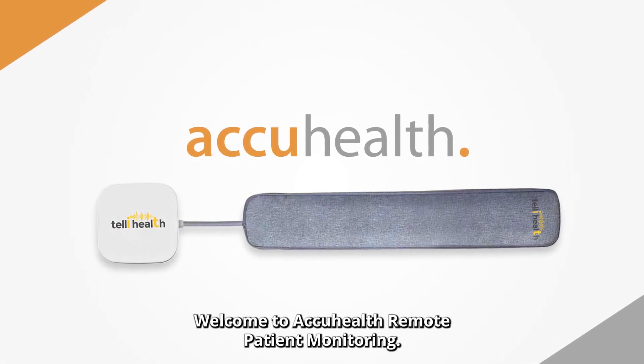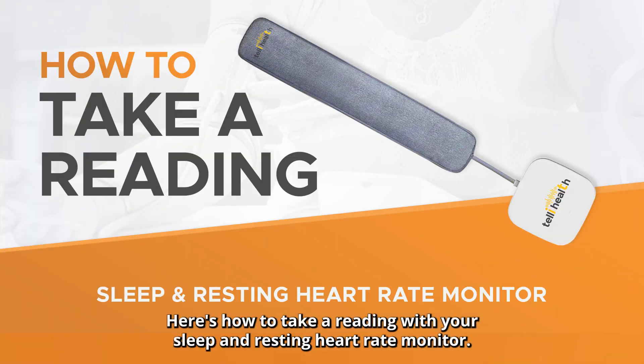Welcome to AccuHealth Remote Patient Monitoring. Here's how to take a reading with your sleep and resting heart rate monitor.